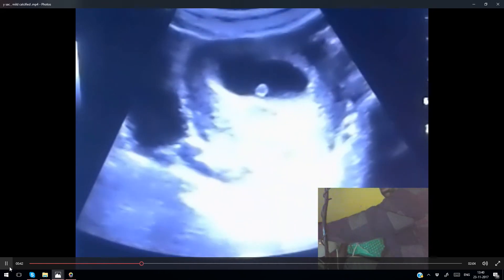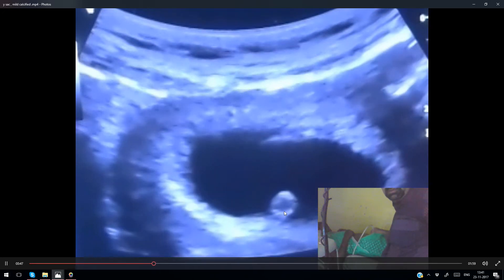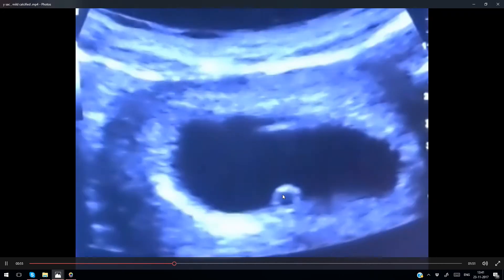I will not stop here — I will extend my scan and go to the yolk sac. This is the yolk sac over here. This yolk sac is not very clear; I am not seeing clear echoes in it. It should be jet black. I am seeing some echoes and some calcified areas here. This is the thickened wall — I can say these are mild calcifications. This type of yolk sac will not be accepted; this is not a normal yolk sac. I am seeing a mildly calcified yolk sac here.